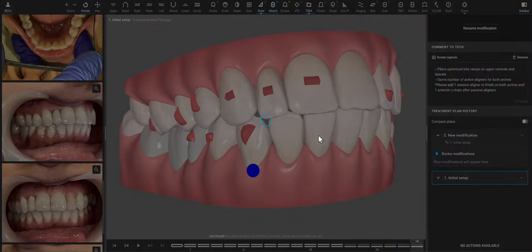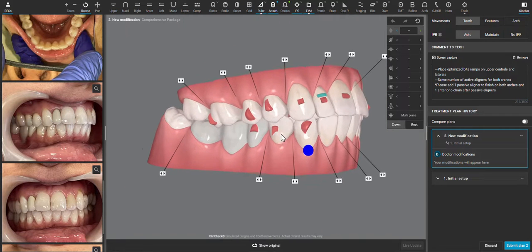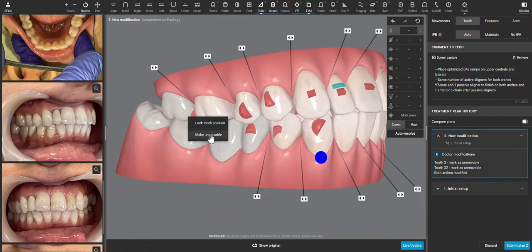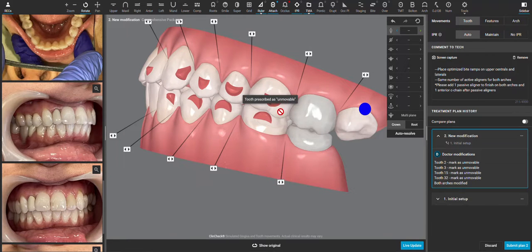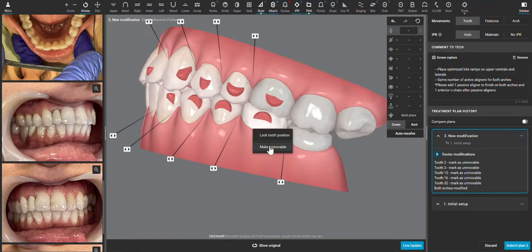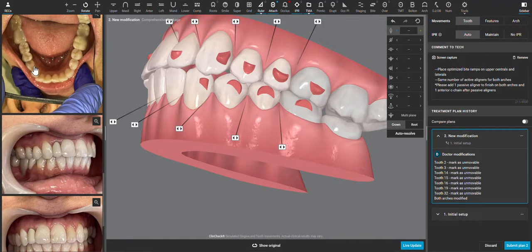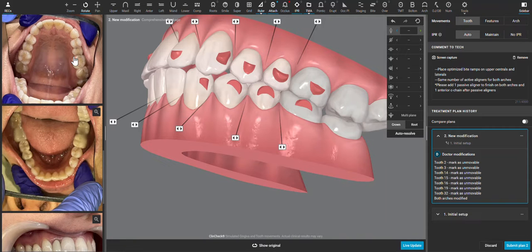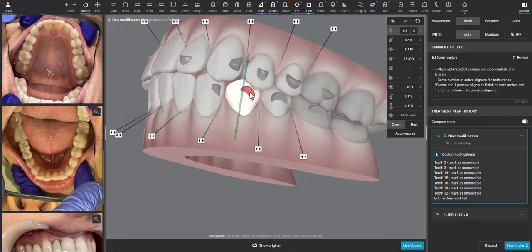I'll go ahead and start modifying. The first thing I want to do is right-click and make all of these teeth unmovable. Then I'm going to look at the premolars and see how they need to move or not move — really we're just looking for expansion. None of these premolars look really out of place, and I don't think that rotating them would be a priority, so I'm going to click on this one.